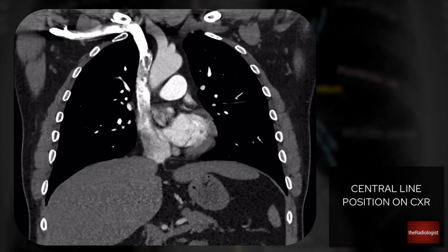Today we're going to look at central line placement on chest x-ray, and we're going to start by looking at a coronal view of a chest CT, as knowing the structures well within the mediastinum can really help with being able to place that line on a chest x-ray.